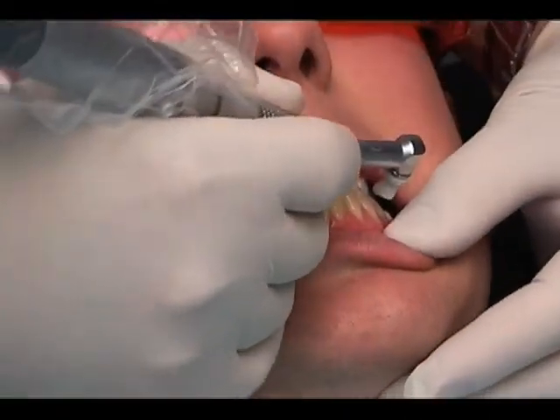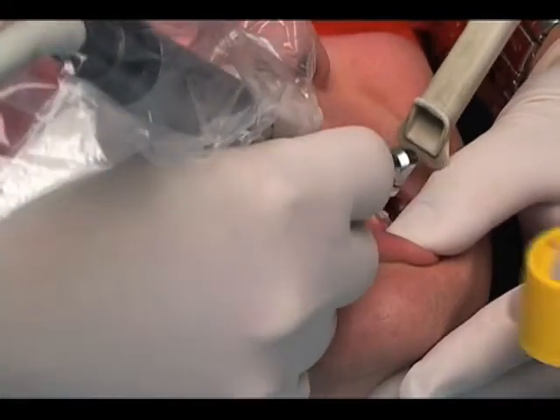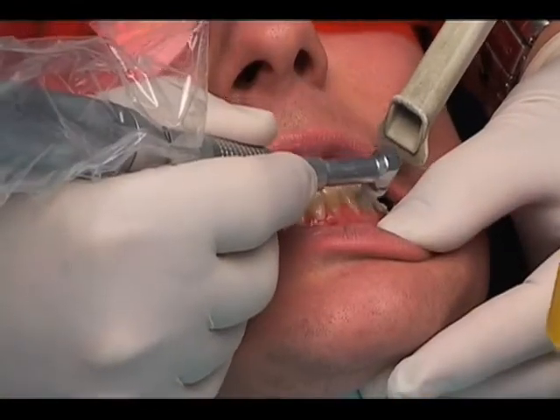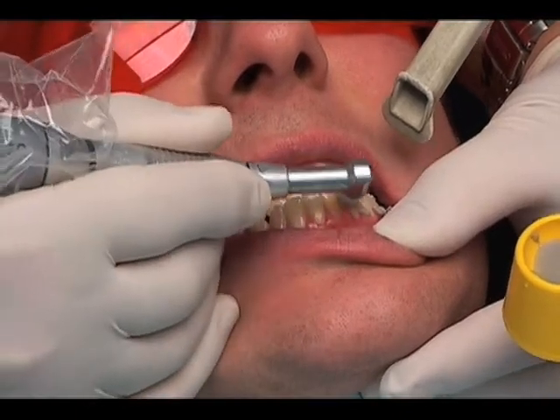Clean the teeth with a profi cup using a flower based pumice that is free of glycerine and fluoride. Your goal is to remove plaque and debris from the teeth to allow the whitening material to stay in close contact with the tooth. Thoroughly rinse the teeth to remove all the pumice.